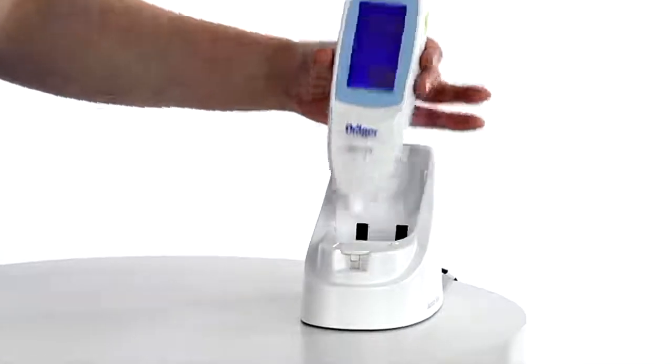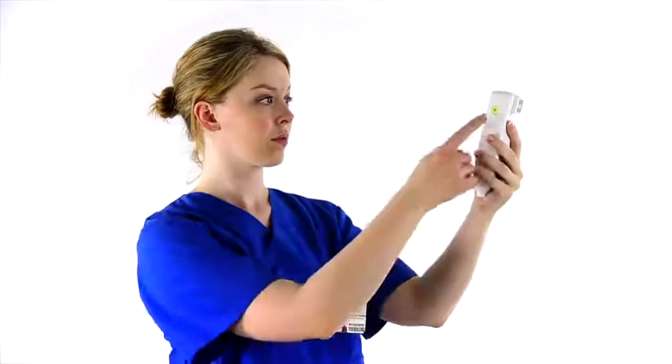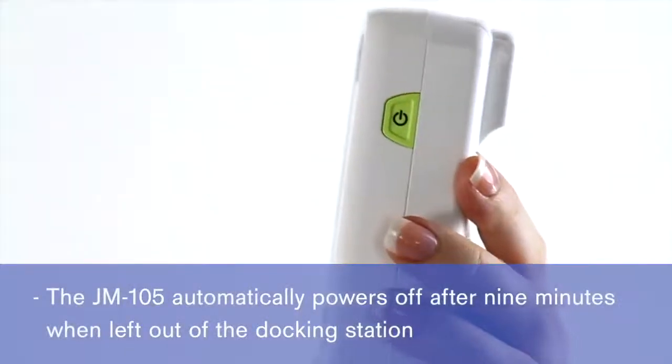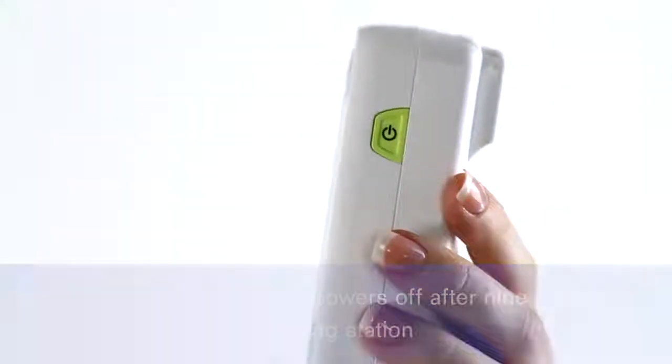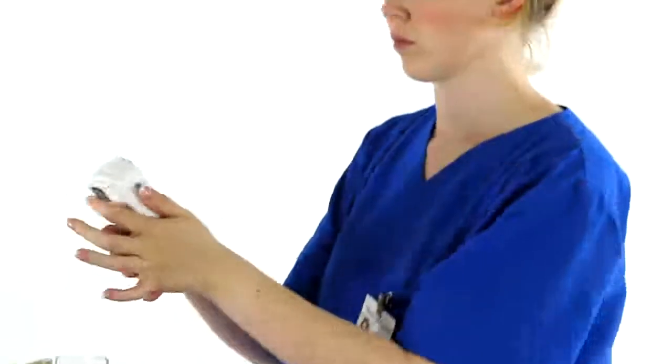First, remove the JM105 from the docking station. The green ready light should come on, indicating that the JM105 is charged and ready to use. If the JM105 was not in the docking station prior to use, it might need to be powered on. If the JM105 is left out of the docking station and not in use for 9 minutes, the power goes off automatically. Clean the measuring probe by wiping it with an alcohol swab and allow to air dry.